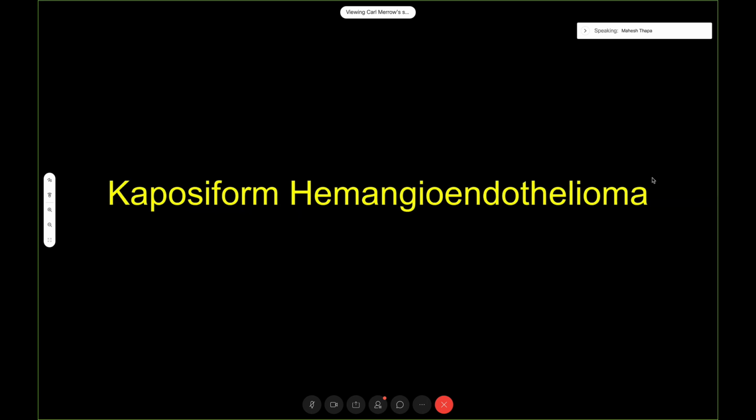If you didn't have the lab data, are there other clues from imaging alone that lead you down the path of Kaposiform hemangioendothelioma and not hemangioma? Yeah, so one of the dividers, there's a few things. Was it there at birth? Classically, the much more common infantile hemangioma shouldn't be there at birth, but it's going to show up in the first few weeks of life. Typically it has a classic cutaneous appearance, but should be lobulated, soft, not firm, fairly well defined on ultrasound. You shouldn't see it infiltrating the deeper soft tissues.